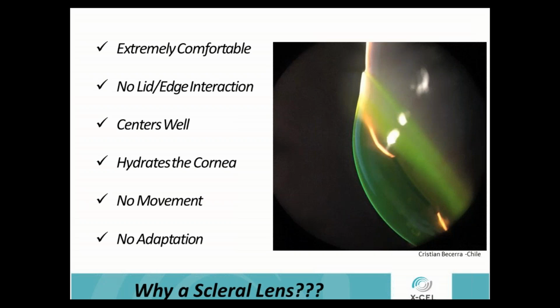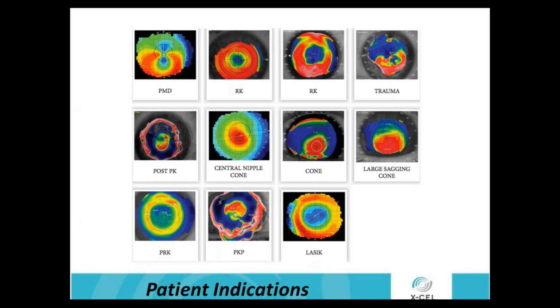Well, with scleral lenses, not that we recommend the patient wear the lens the first day for a full day, but there's very little adaptation, meaning the discomfort and adapting to that discomfort. So some of these patients can go a full day straight out of the gates that first day. So there's very little adaptation period or no adaptation period. So those are all the advantages we saw.